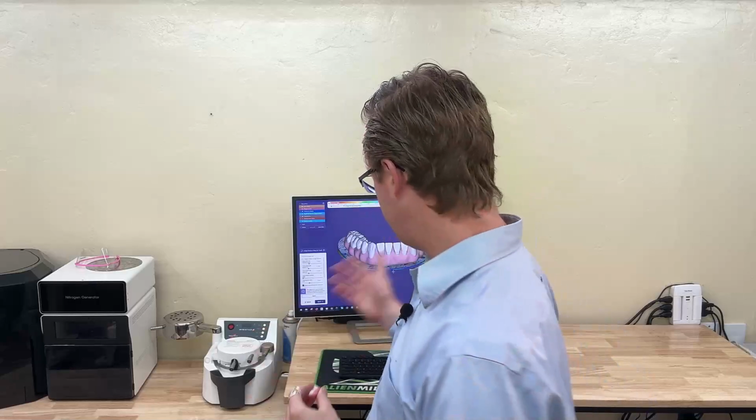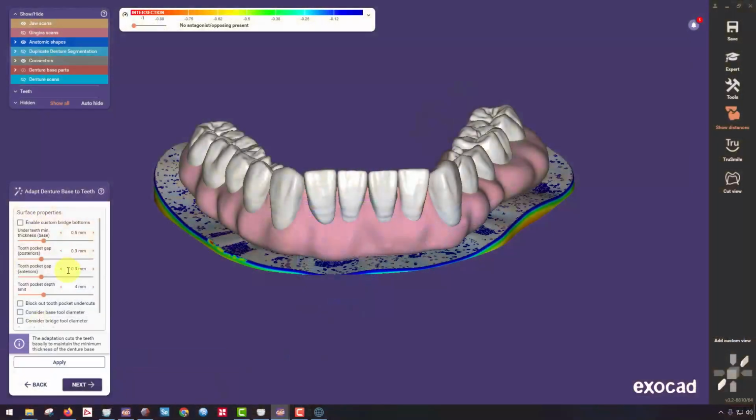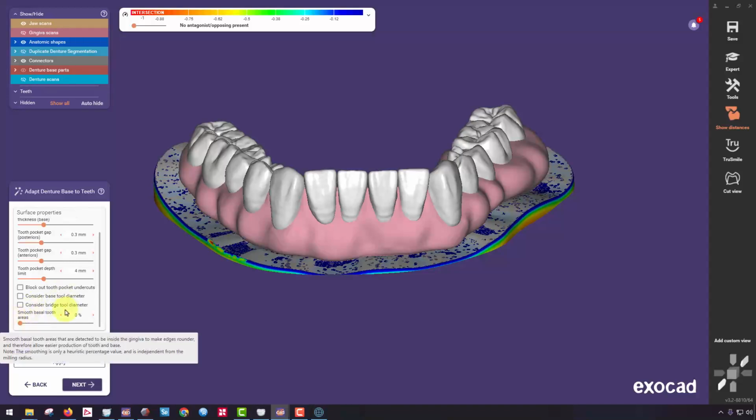Now, typically I want at least 0.5 millimeters of space underneath my restoration. And then I typically set the same pocket gap between anterior and posterior. So if I choose 0.5, I do it for both the anterior and posterior. And then also right in here, what I don't necessarily want to do is block out any tooth pocket undercuts if I'm 3D printing. If I am milling, I do want to block out any tooth pocket undercuts, all right? Just because of the milling machine. You can see here, I can also choose milling specific functions, such as considering the base tool diameter. I can click that, and set a tool diameter of 1 millimeter, that would be what I would do here, et cetera, et cetera.